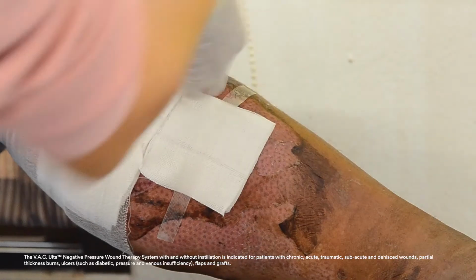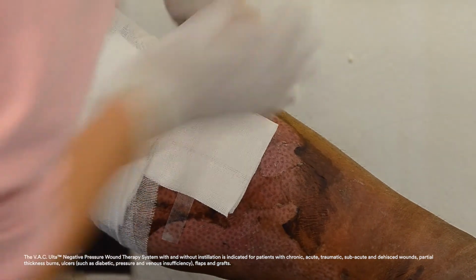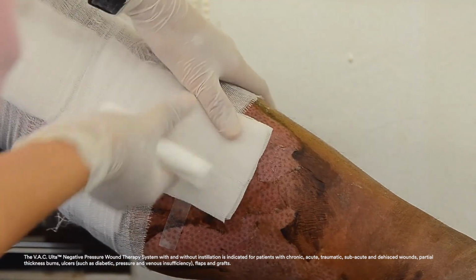Okay. I'm never using standard negative pressure by itself ever again. My question is, why wouldn't you use instillation on everything? If it's on a skin graft, I'm going to use standard care. I get that, because you're not going to instill over top of a skin graft. Got it. But for every other wound, I'm trying to find a reason not to put instillation in it.